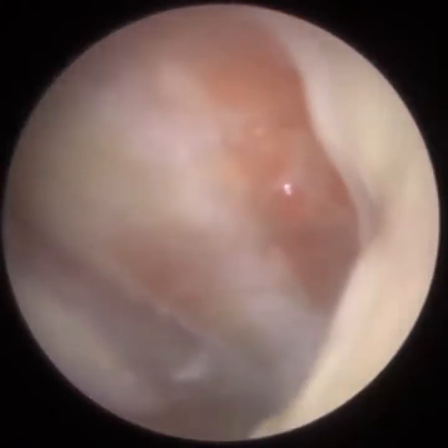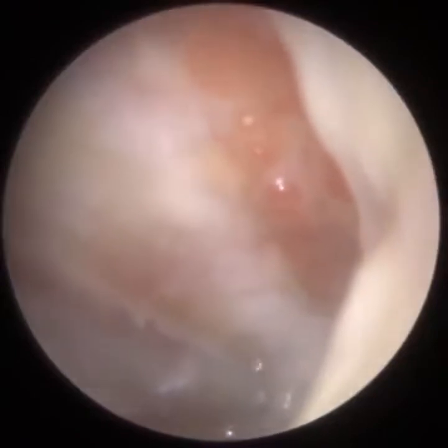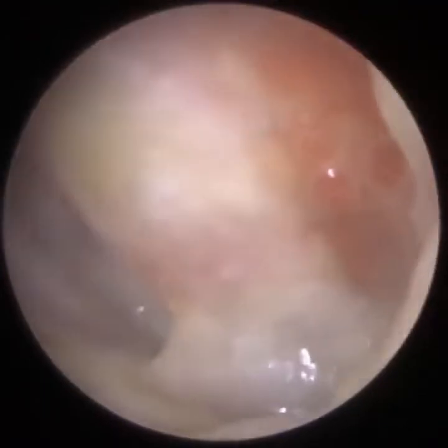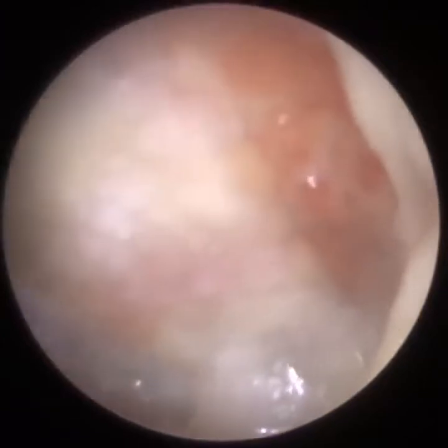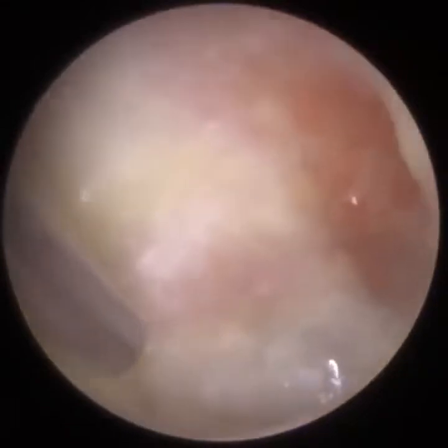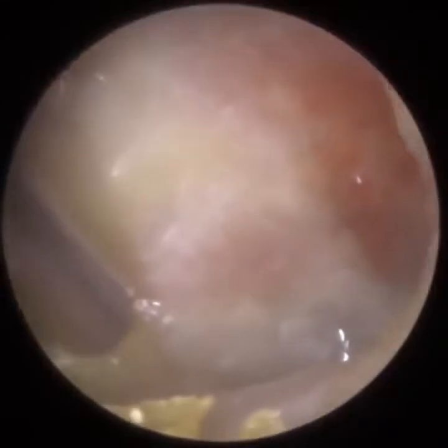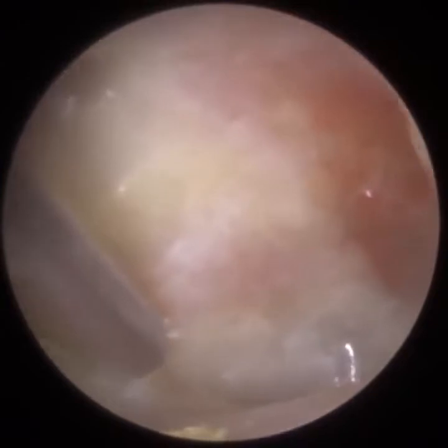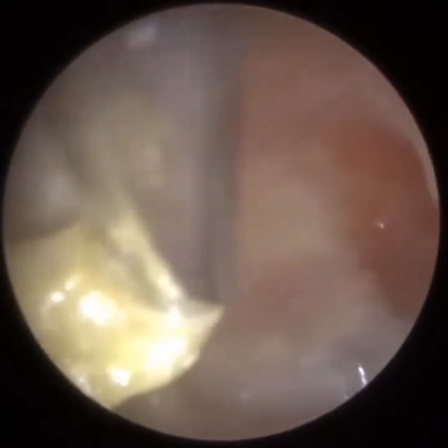Just working very closely on the eardrum. The eardrum's still very damp and wet. We have to be very, very gentle when we're working this close to the eardrum. The eardrum is very delicate. It's 0.1 millimeters in thickness. When we work this close, invariably the patient does move. The patient's not a scarecrow or a robot, so there are little head movements, even when you rest their head against the back of the chair. So we have to be really, really gentle, and whenever I'm working this close to the eardrum, I'm always prepared to remove the instruments in the blink of an eye, just in case the patient makes a significant head movement, to avoid causing trauma.